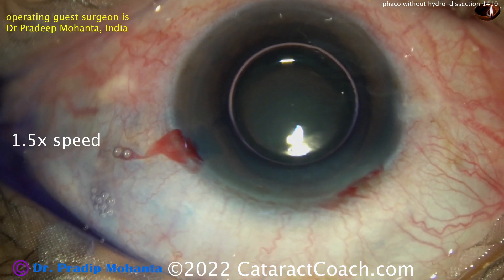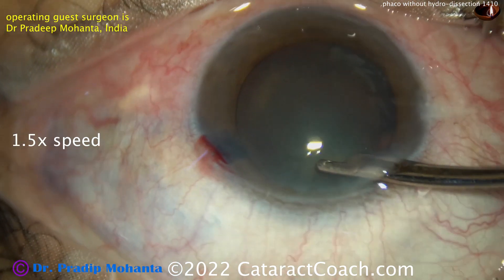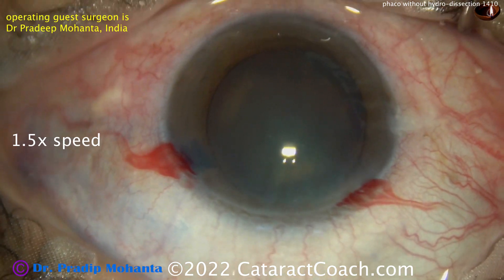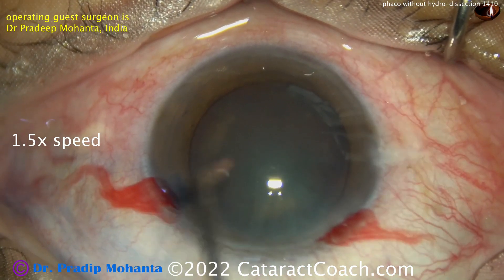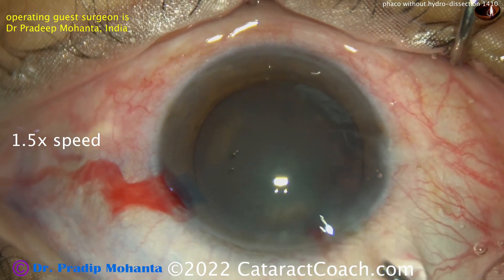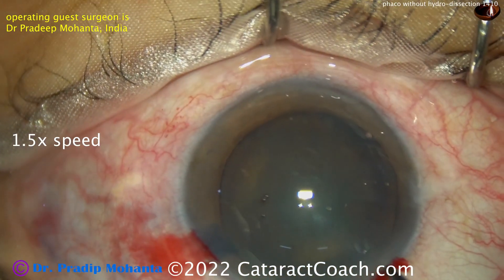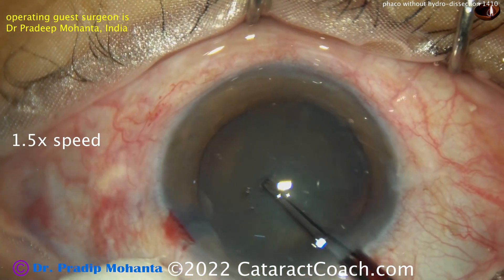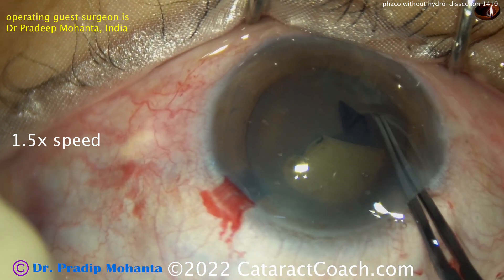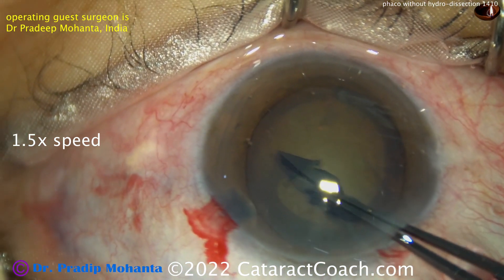A little trypan blue dye is going inside the eye, and then it's washed out to perform the capsulorhexis. If you're going to do this case without any hydrodissection, you may still want to consider hydrodelineation, and you want to make a sufficiently large capsulorhexis — at least 5mm. The trypan blue dye of course helped a lot here.